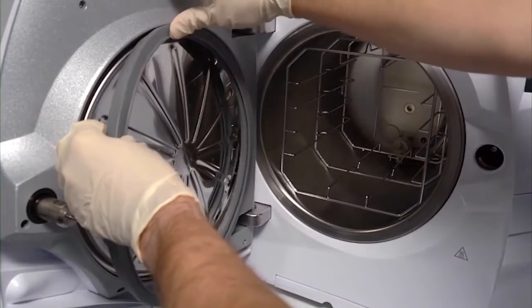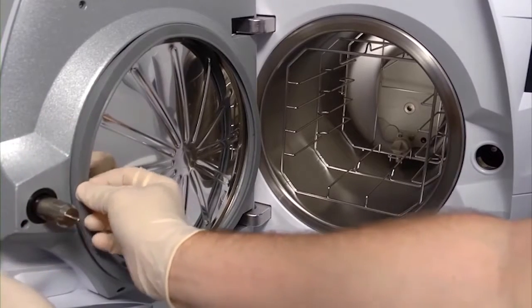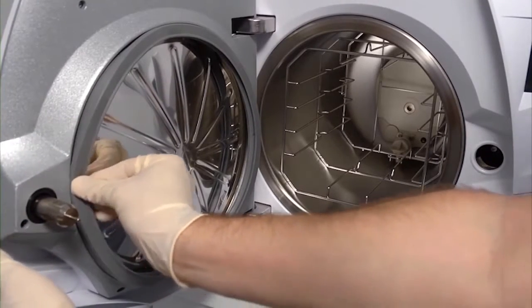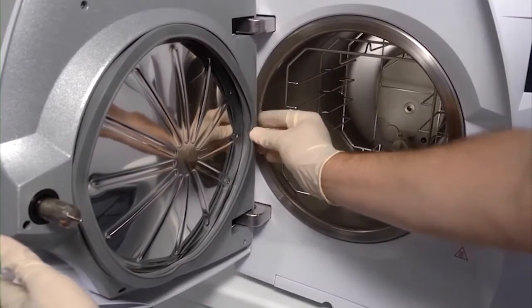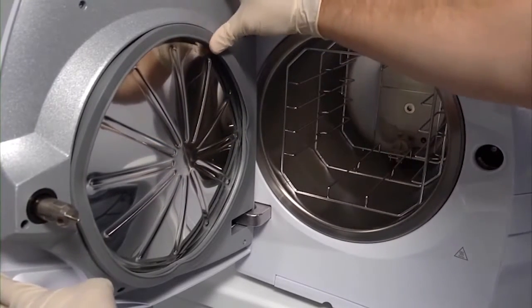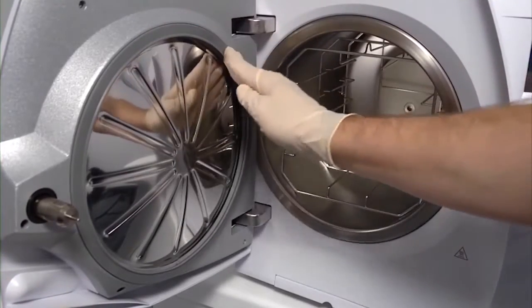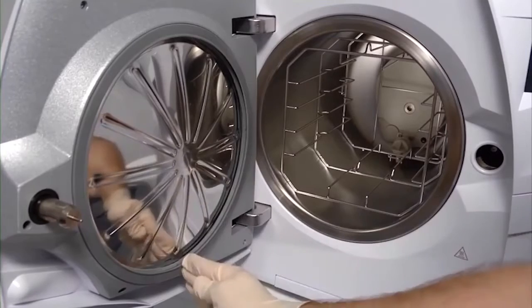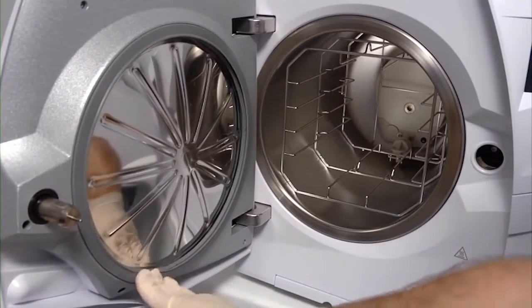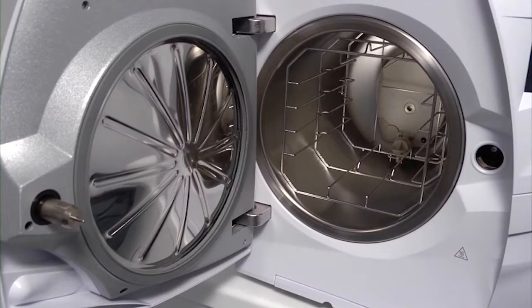Start by pressing the door seal into the seat at the top and bottom, then left and right. The remaining areas of the door seal can now be pressed evenly into place over its entire circumference. It is important to make sure that there are no bumps or deformations when the door seal is fitted. Correct fitting will prevent air leaks during the sterilisation cycle.